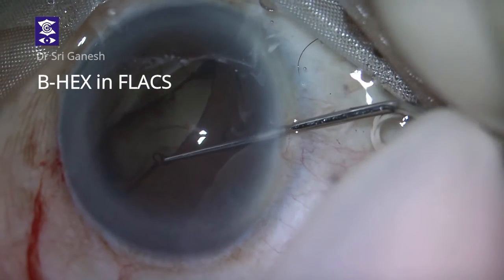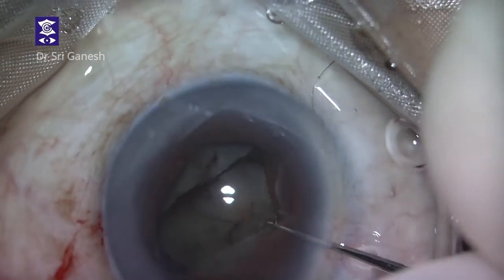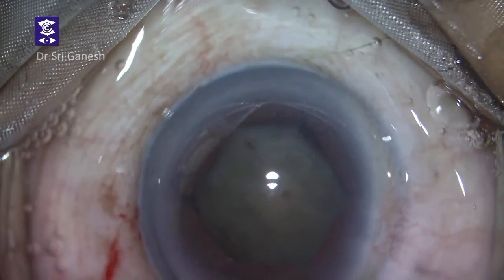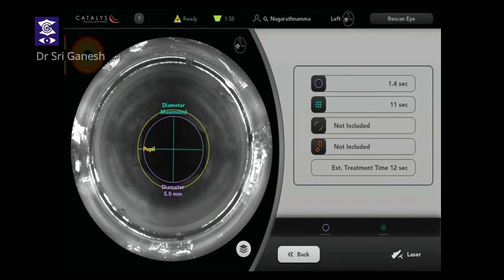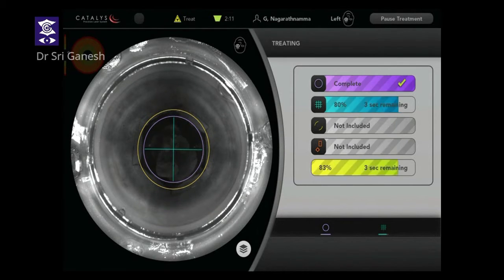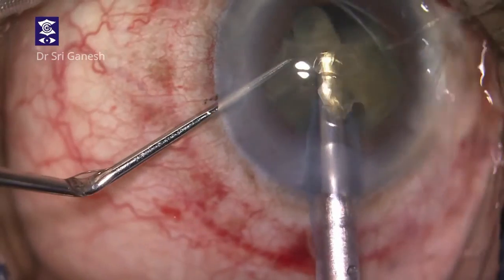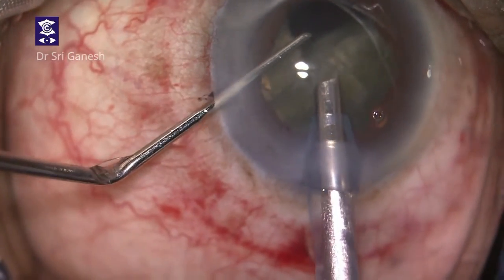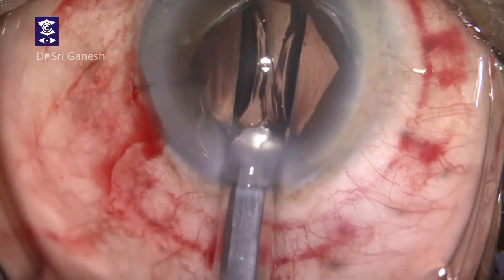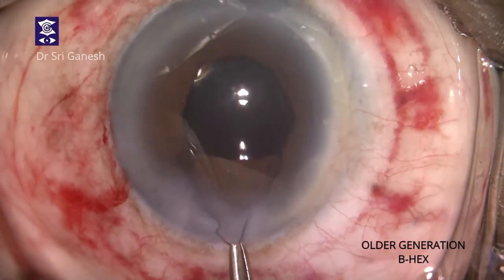This is a femtolaser cataract surgery with an older generation BHEX pupil expander. The hexagonal pupil is seen after docking and the pupil diameter is fixed while the treatment is completed. The free-floating capsule is removed, phacoemulsification is completed, and IOL implantation is again easy because of the visibility. Removal of the BHEX is as usual very easy.